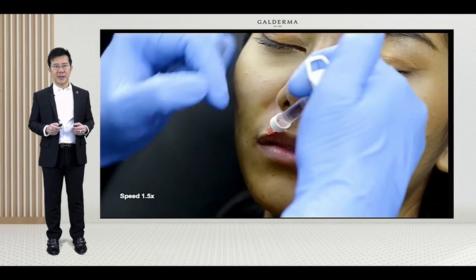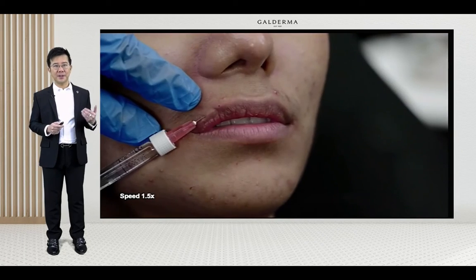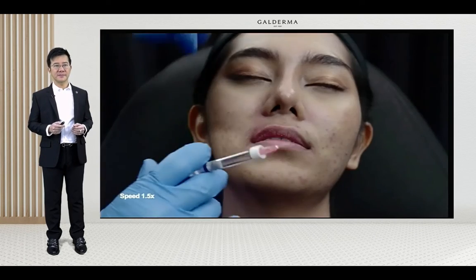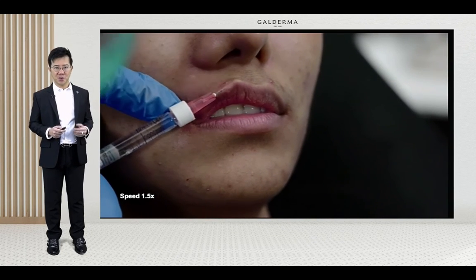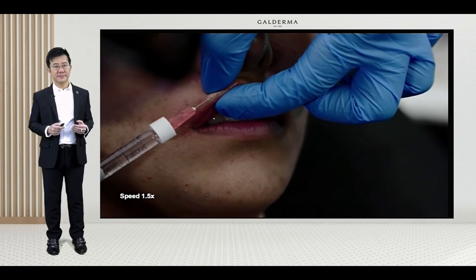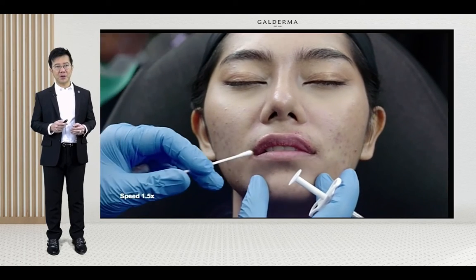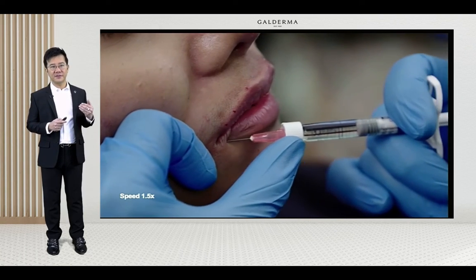I use the same approach as the previous case. Start to inject at the upper lips to create a small lateral bulge with superficial injection, and then inject the vermilion border to create better contour. Use 2 fingers to control the product, and to keep it bold. As I mentioned before, I want to support the lower lip corner. That will improve lifting for the corner of the mouth.